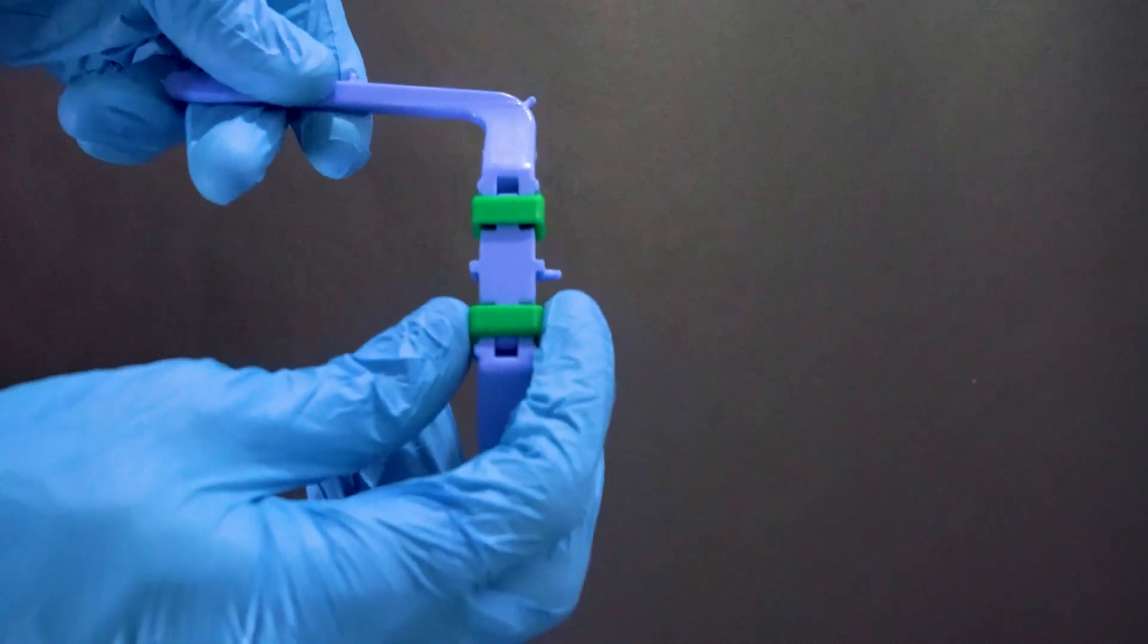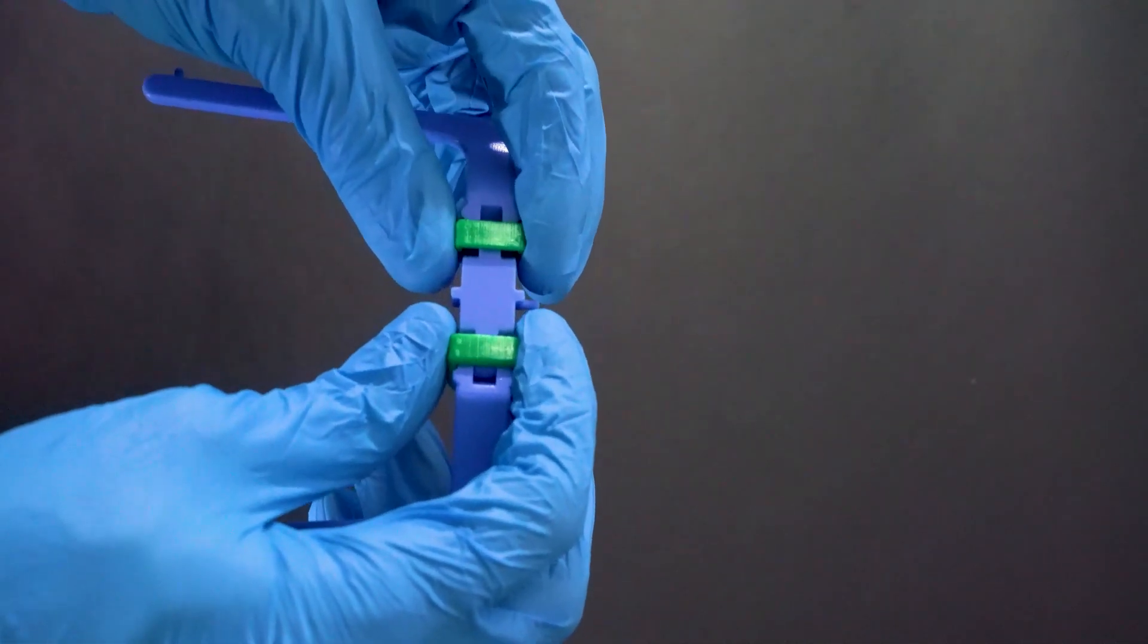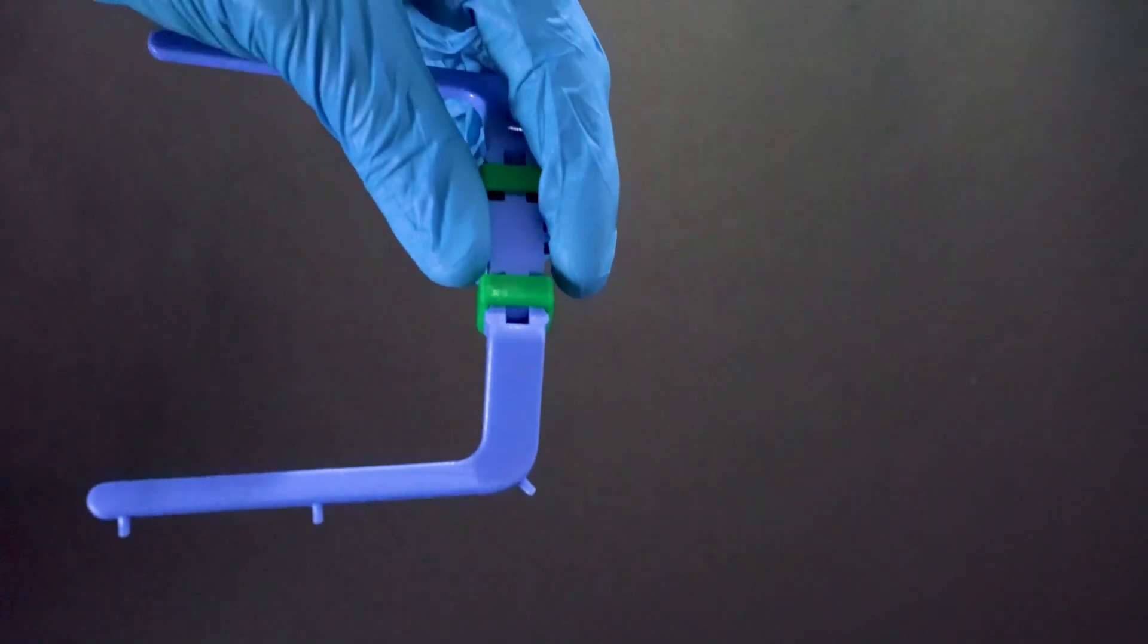To place the rubber dam on the frame, the two sliding bars are placed in the locking position and the rubber dam can be placed on the frame.